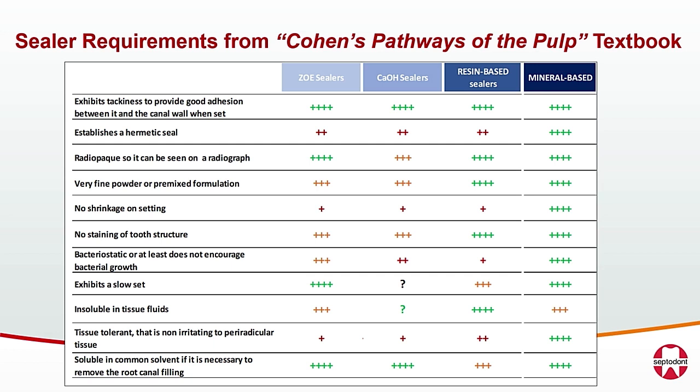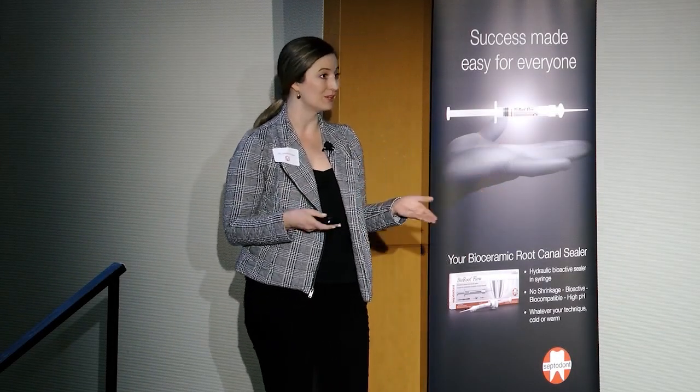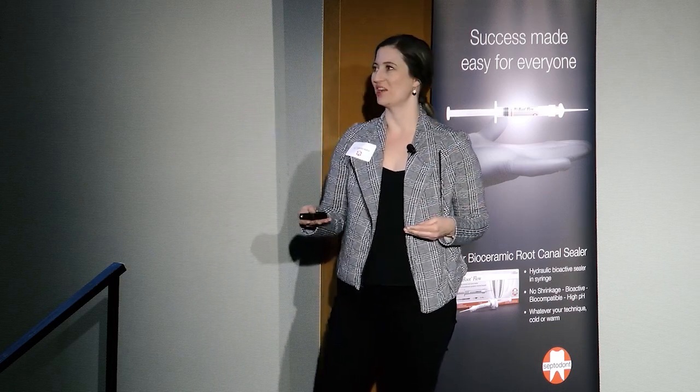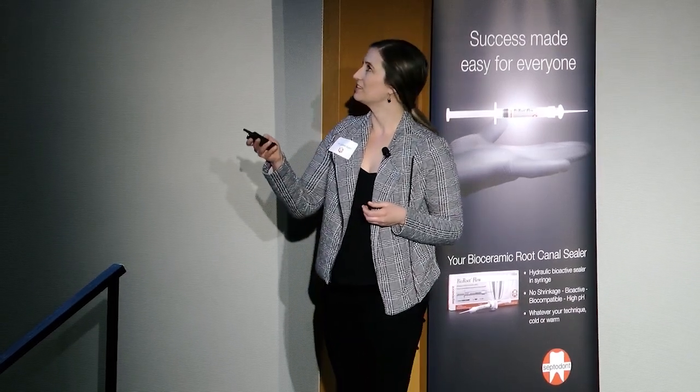So when we're looking for a sealer, there's a lot that we're looking for, right? We're looking for something that's going to be retreatable, but we also want it to be strong. We want it to be antimicrobial whenever possible. We want it to be affordable. We want it to not stain teeth. We don't want it to dissolve in tissue fluids, and we like it to be pure and not have contaminants in it. And we look at different sealers like zinc oxide eugenol sealers, like Kerr Pulp Canal Sealer or Roth sealer, which are very commonplace.